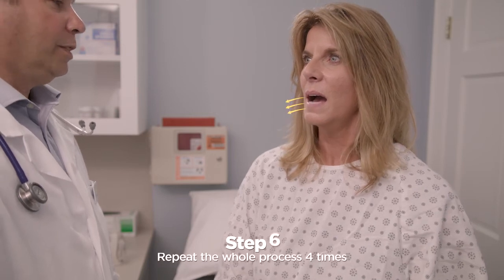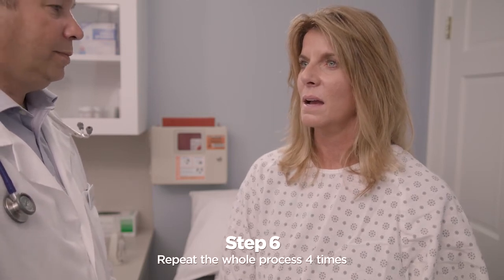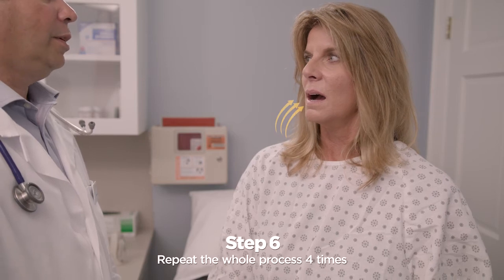Repeat this maneuver two more times and then follow with one strong cough to clear mucus from the larger airways. Now repeat the breathing and huff coughing cycle four times, or as directed by your healthcare practitioner.